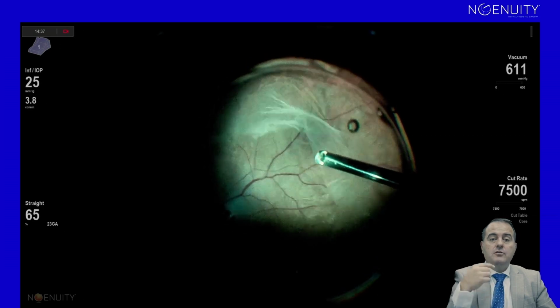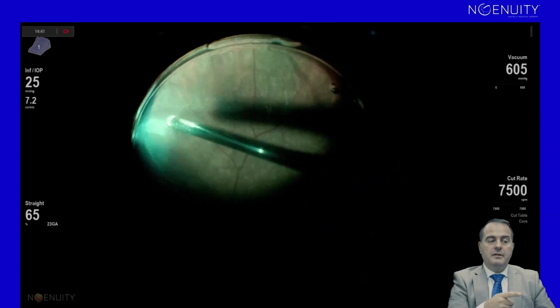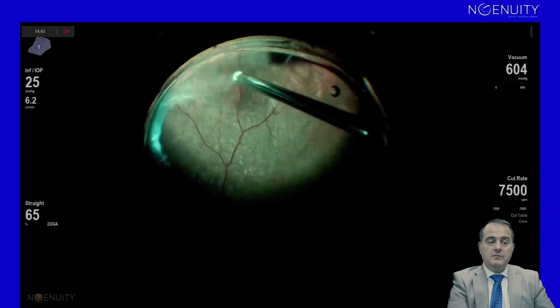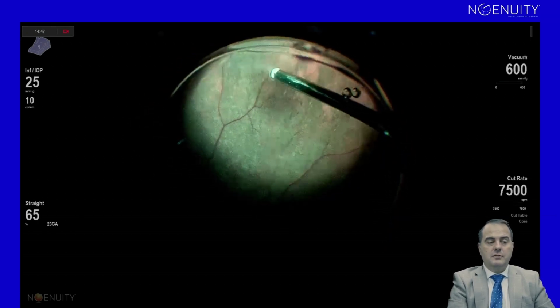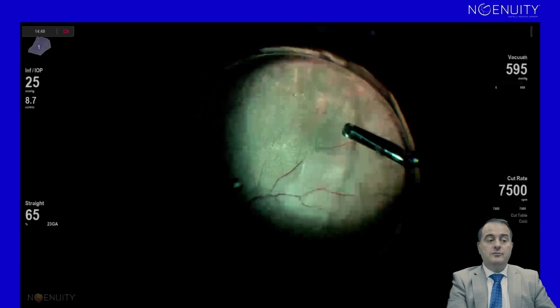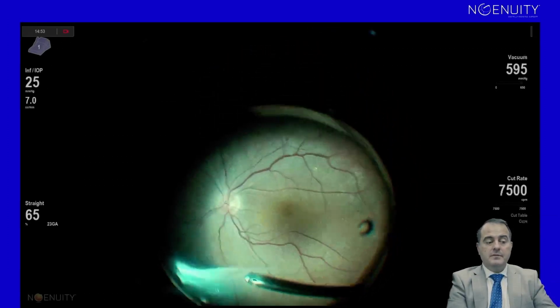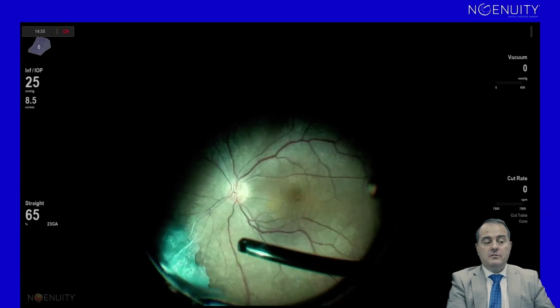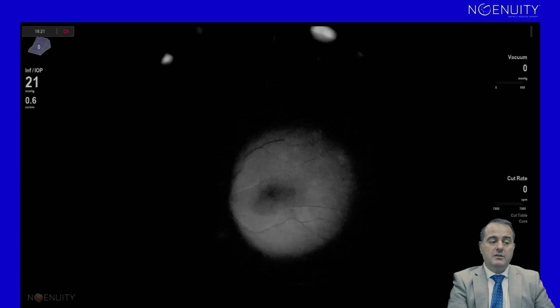Here we might not use a dye at all, just a digital filter. You see here the vitreous under a digital visualization. So the filter is dedicated to highlight the collagen fibers, and you can see pretty well this vitreous. Of course, it's a matter of fundus reflectivity also.